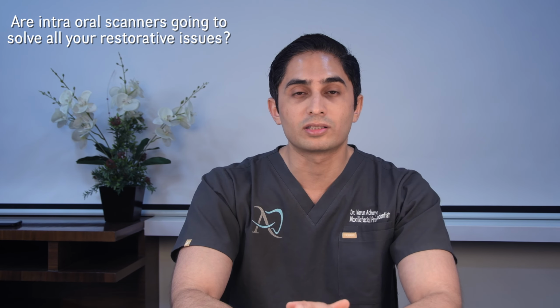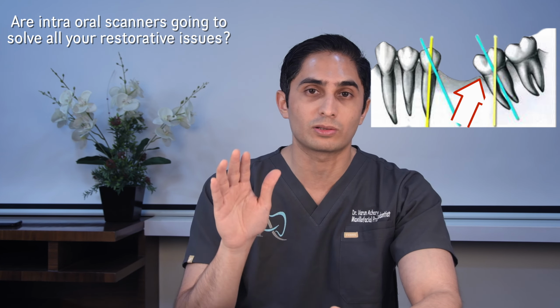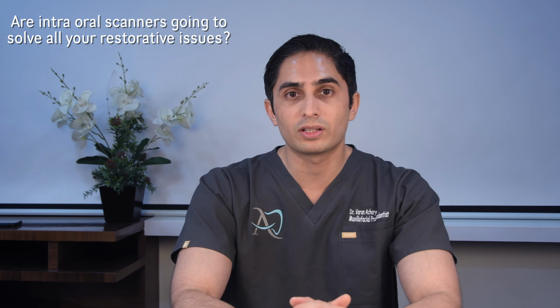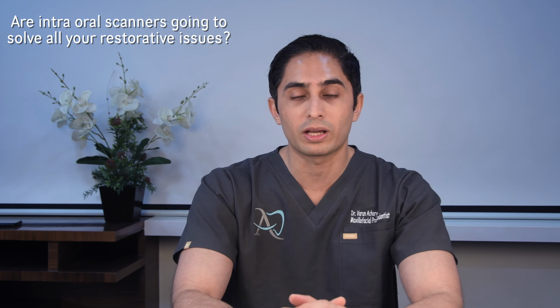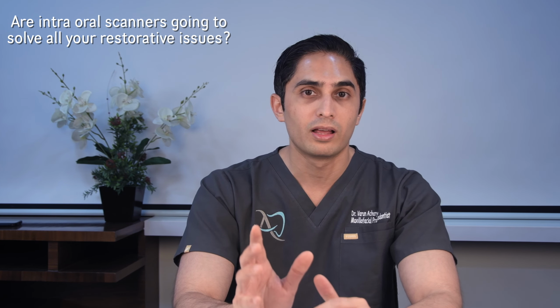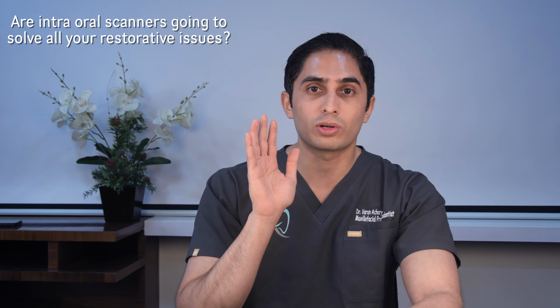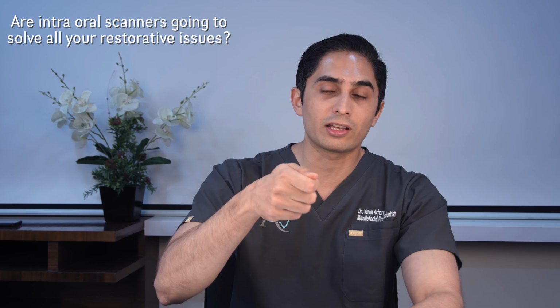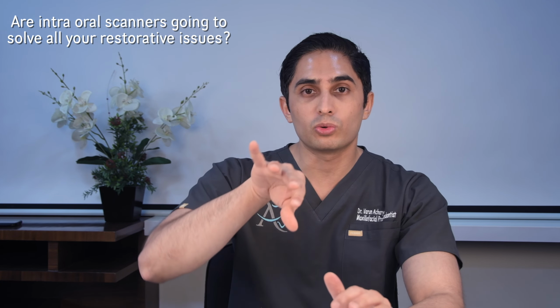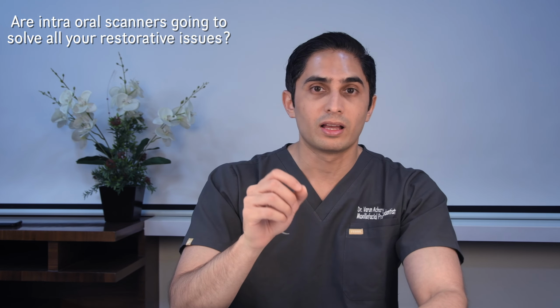You may have other situations where you have, let's say, a missing number 6 and number 7 has drifted into that space, so it's mesially tilted. Getting an impression of this is not very difficult. Granted, you may lock into an undercut, but those you should be able to remove with a flexible impression material. But with scanners, you're going to have a real problem trying to get the contacts. You want to get the contacts of number 7, but they are in an undercut location, and trying to angulate your scanner in such a way to capture all of that contact detail of number 7 because you're making a crown on number 6 is going to be a little challenging, especially the first few times you do it.